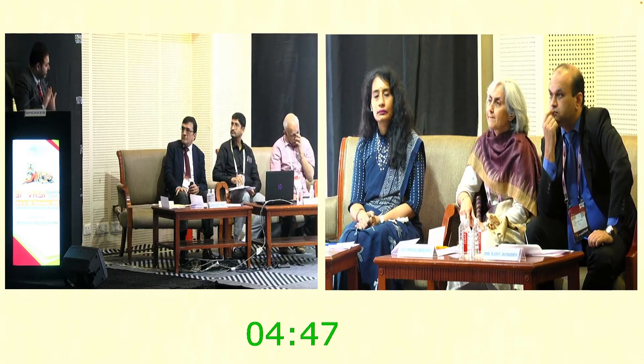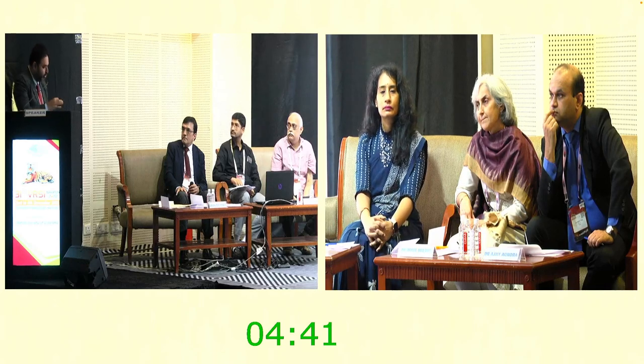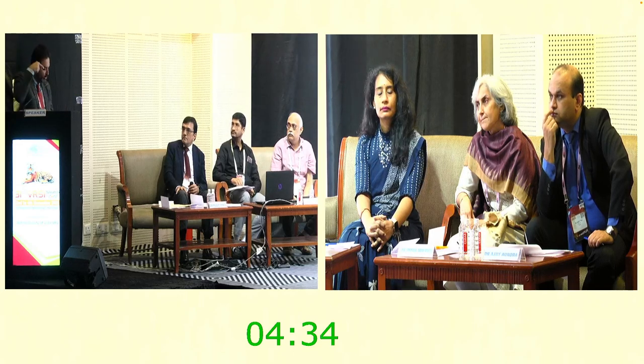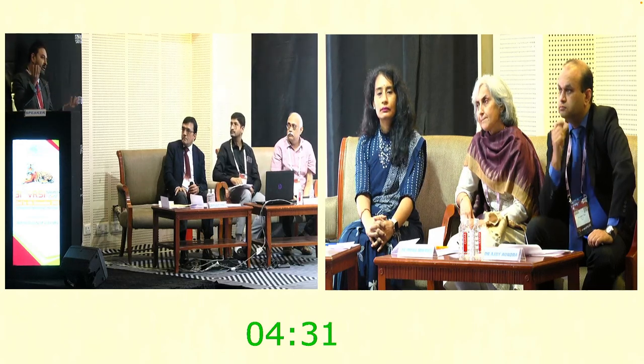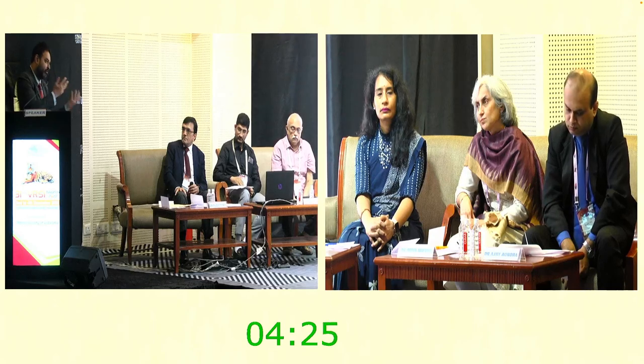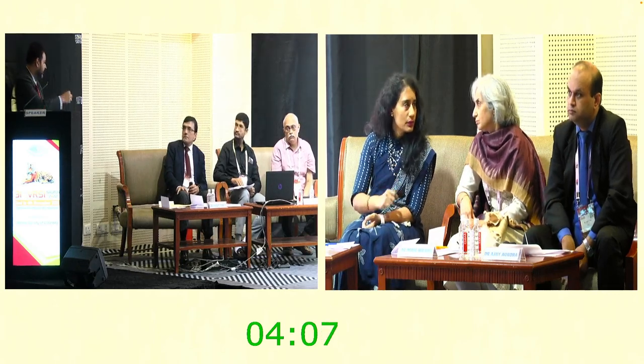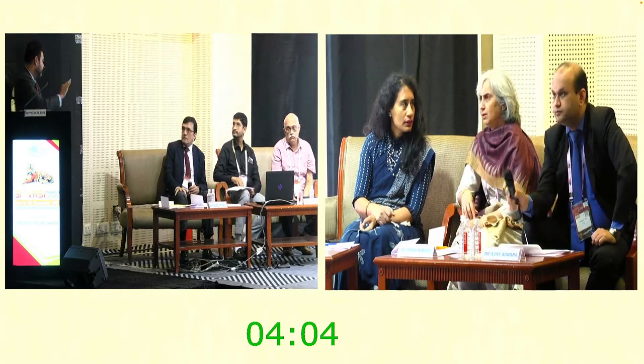So this is passive aspiration. It's not machine linked. So just a soft tip cannula goes onto a 2cc syringe and the plunger is off. We use the passive capillary action, and we go straight into it like one would do a passive fluid air exchange during Reg RD, FAX, if one were to really go slow, like some people tend to do. So it's not machine linked. It's not active. And we need a 2cc syringe, so if it's a 41 gauge, those cells will not come up, because for the capillary action to occur, we need a little bigger bore. Otherwise, the capillary action will go down because it's proportional to the fourth power of the radius.